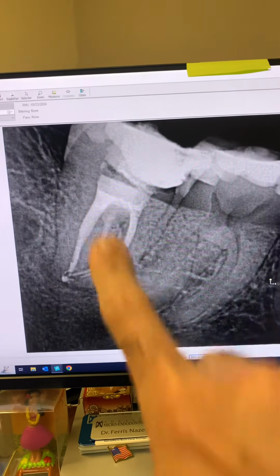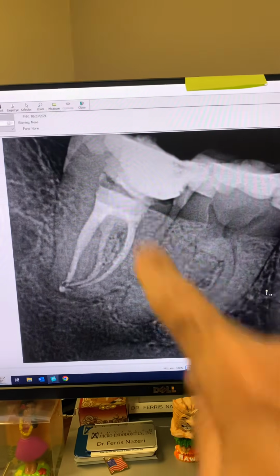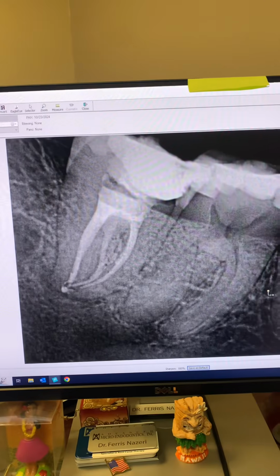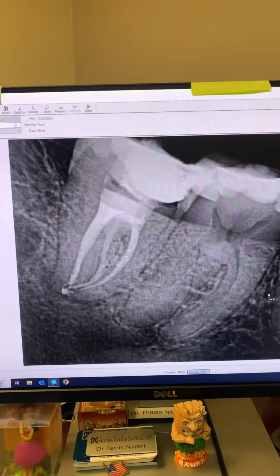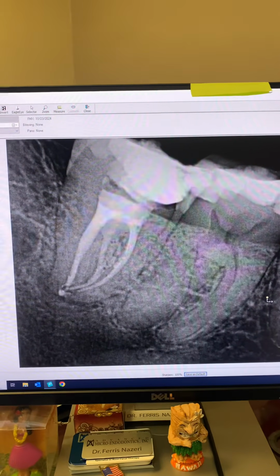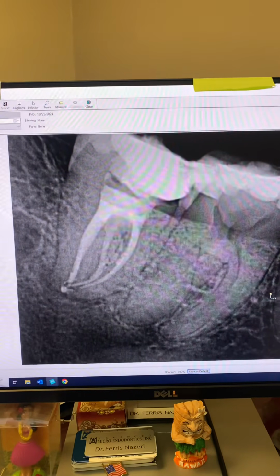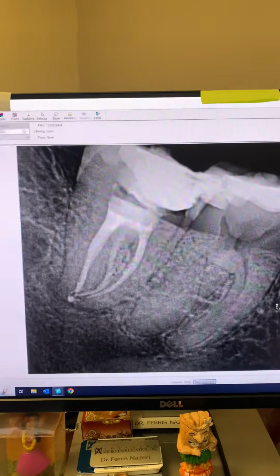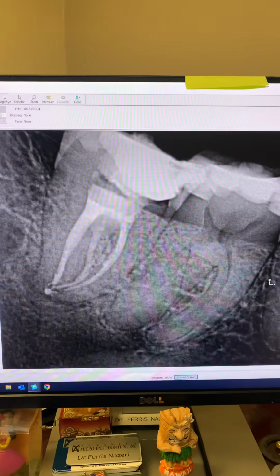We went ahead and temporized the tooth, and the patient's going back to his dentist to have tooth number 31 restored permanently. And I will talk to the patient about teeth number 4, number 13, and number 14, about the guarded prognosis for these teeth, especially tooth number 14. I'll make sure to tell the patient about that broken file in the mesiobuccal root of tooth number 14, that we may not be able to remove it.